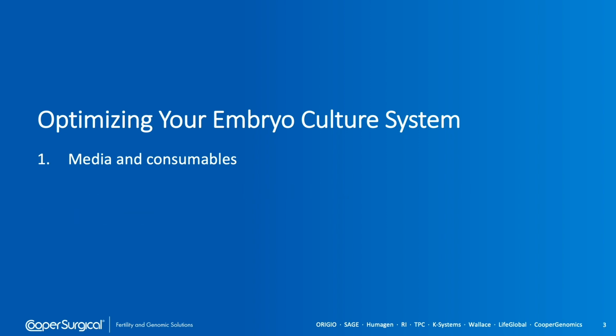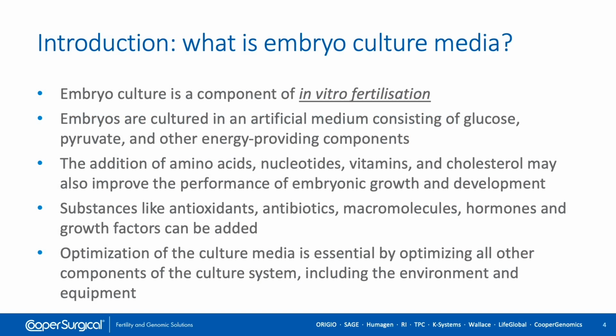So first of all, media and consumables. What is embryo culture media as a starting point, and how do we optimize its use within the culture system that we have in our laboratory? So what is embryo culture media?